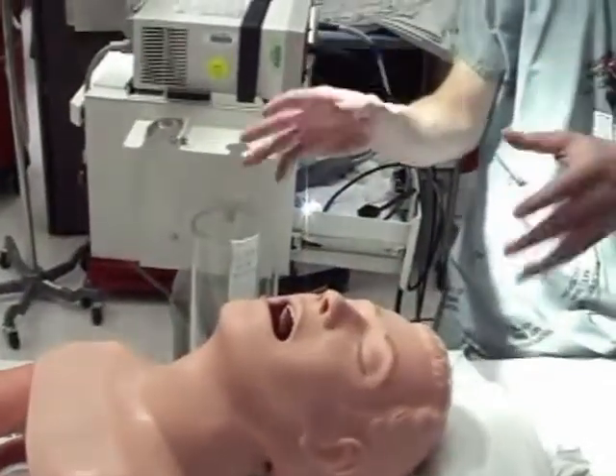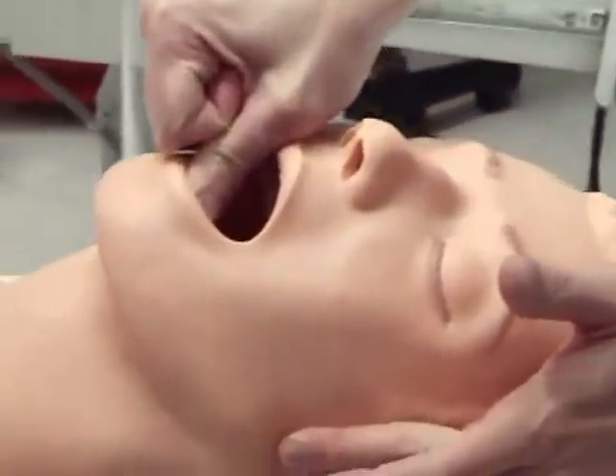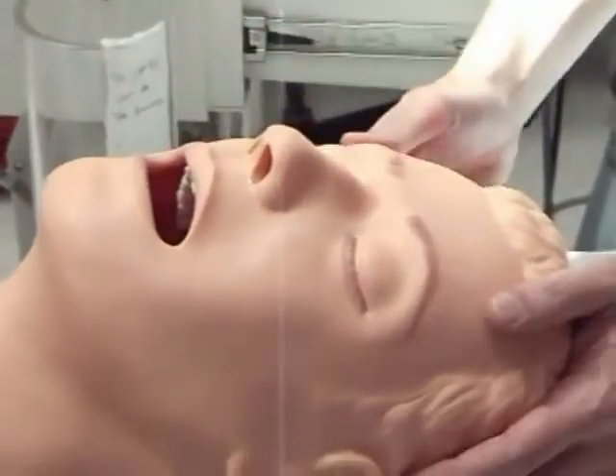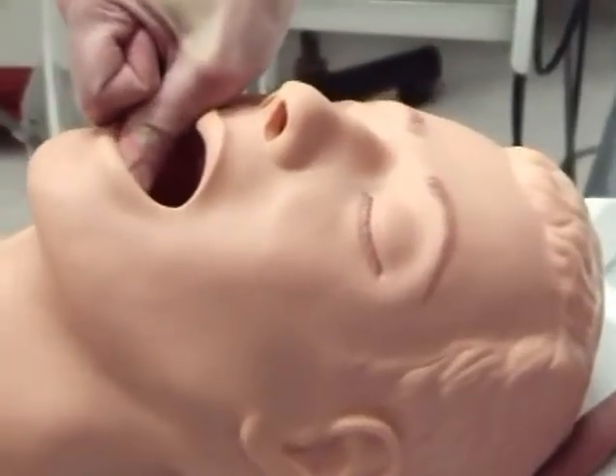The next step is to open the mouth. If you don't open the mouth wide enough to translate your mandibular processes, you can't dislocate the jaw when you try to intubate the patient. Push your fingers one centimeter forward and one centimeter down from your auditory meatus, then slowly open your mouth, and you'll feel your mandible pop out against your fingers. Until that point, you cannot intubate the patient very easily. Open the mouth as wide as possible — especially for trauma patients where the head isn't tilted back and the jaw isn't opening automatically. Use scissor technique for a wide mouth opening.